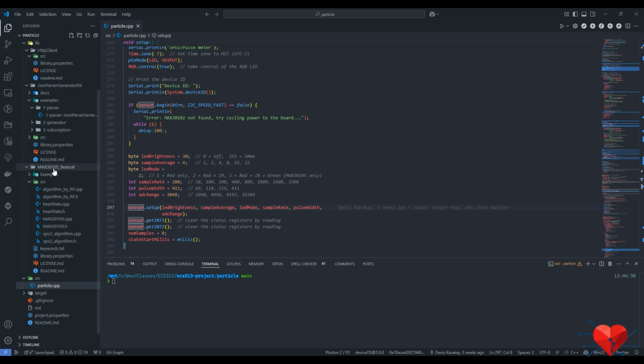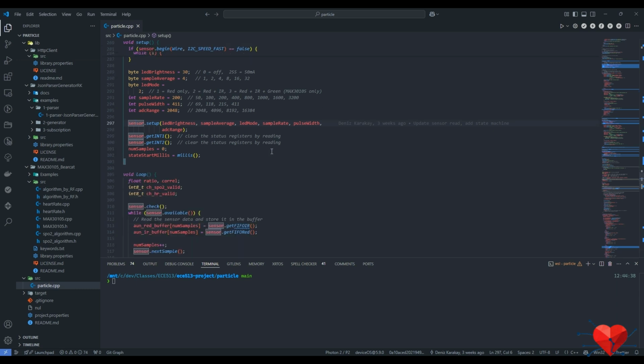In here we are setting our pins and the sensor using the Max 30105 library. So those parameters, I tried multiple of them. I tried different variations, and these are the final parameters that we are using.